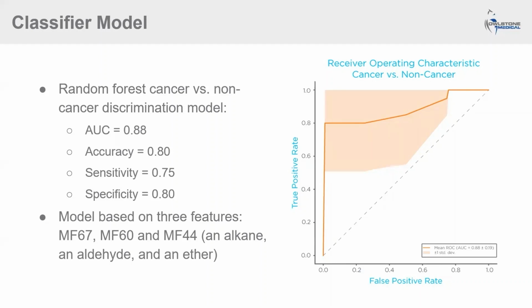We're keenly aware that this is a pilot study that is limited by a small sample size, and this approach could be over or underestimating performance. However, the data are highly encouraging and demonstrate that value can be provided when incorporating breath biomarkers into lung cancer screening strategies.